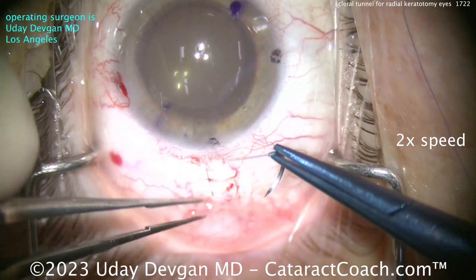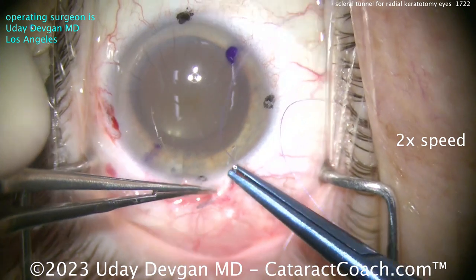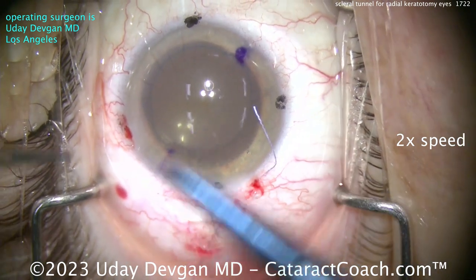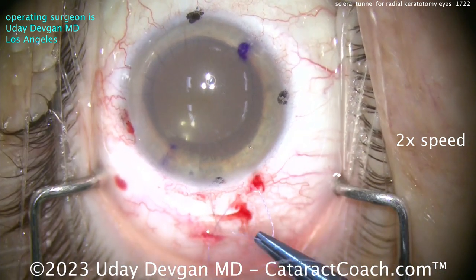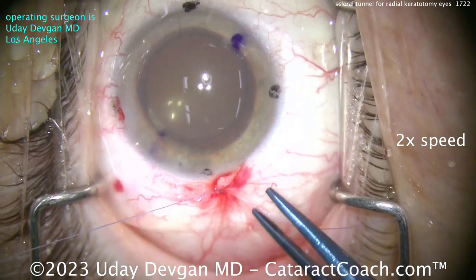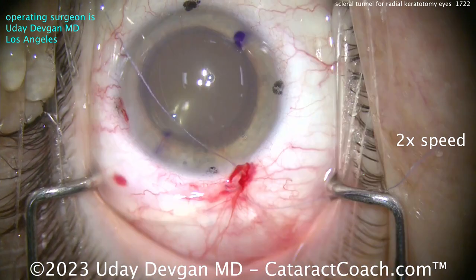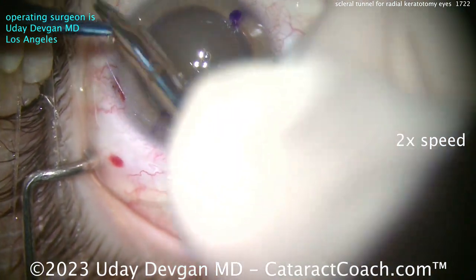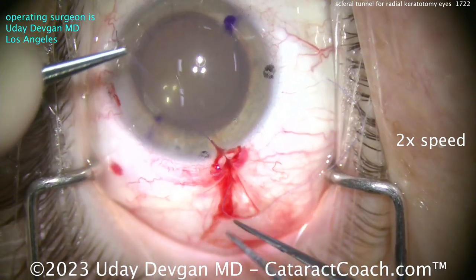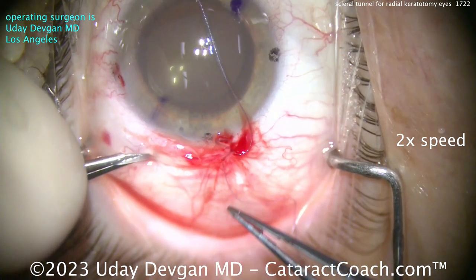Could you have done a corneal incision? You can do anything you want, but I just want to avoid any further risk — I don't want to be blamed should anything happen to that cornea; I didn't touch it. We closed the main incision with a 10-0 nylon suture, and this is using an 8-0 Vicryl. We'll tighten it down. This Vicryl suture on the surface is temporary — it'll last maybe a couple of weeks, maybe even a month, then it'll dissolve on its own and wash out in the patient's tear film.